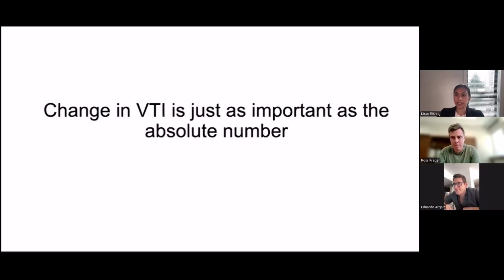Yeah, I totally agree. And I think that really brings Ross's point to the forefront: how much of the LV dysfunction that we often see in, say, septic cardiomyopathy is a cosmetic issue rather than something that's causing ongoing hypoperfusion. I've definitely had circumstances where you see that depressed LV systolic function, they're in shock, and you say, okay, I'm going to start an inotropic agent. And I had a good case recently where it dropped my VTI rather than improving it. And that in my mind, well, that's not the issue, right? It's not a pump issue that's causing my ongoing shock.